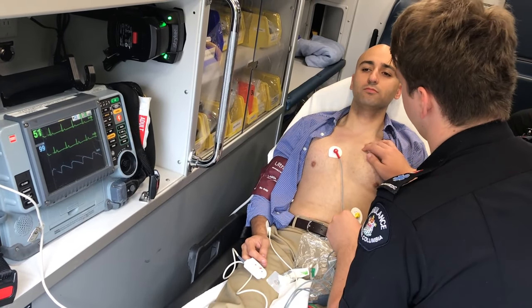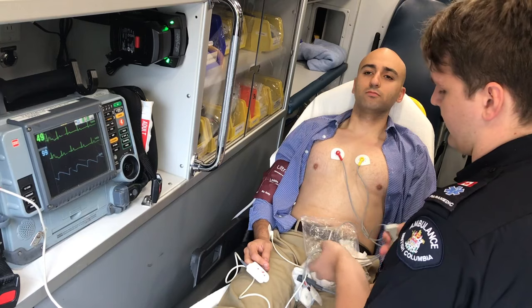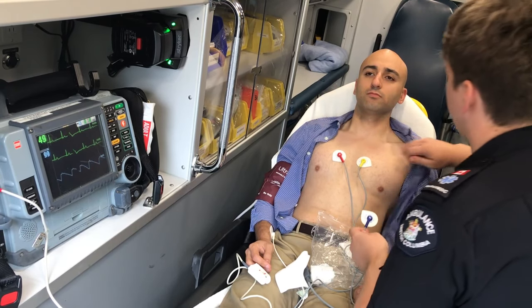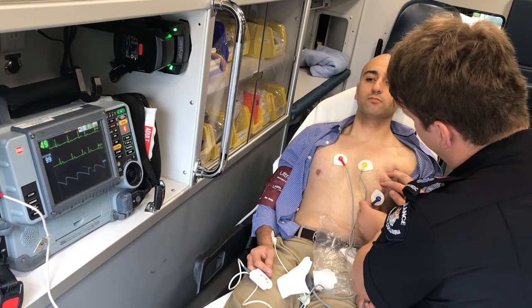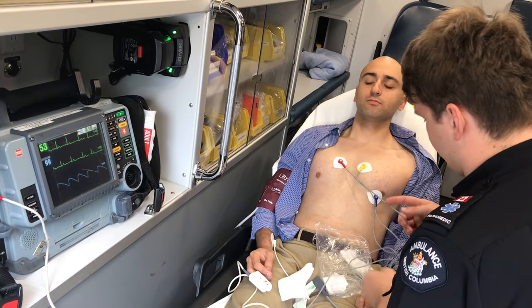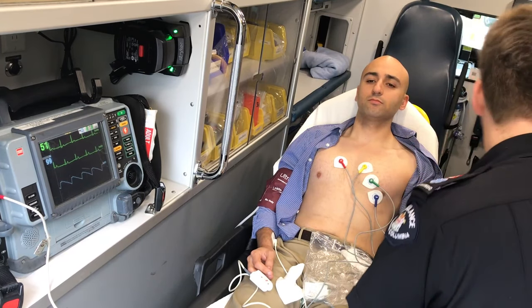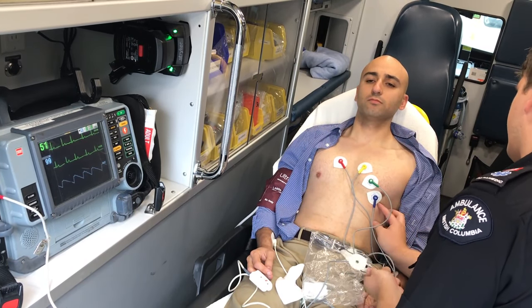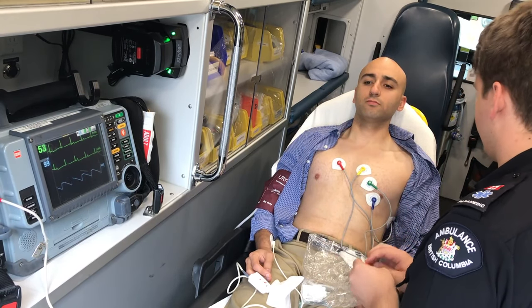And the same on the left. Going up to V4 at the 5th intercostal, midclavicular line. V3 directly in between those two. V6 on the same line as V4 at the mid-axillary line. And V5 halfway between those two.